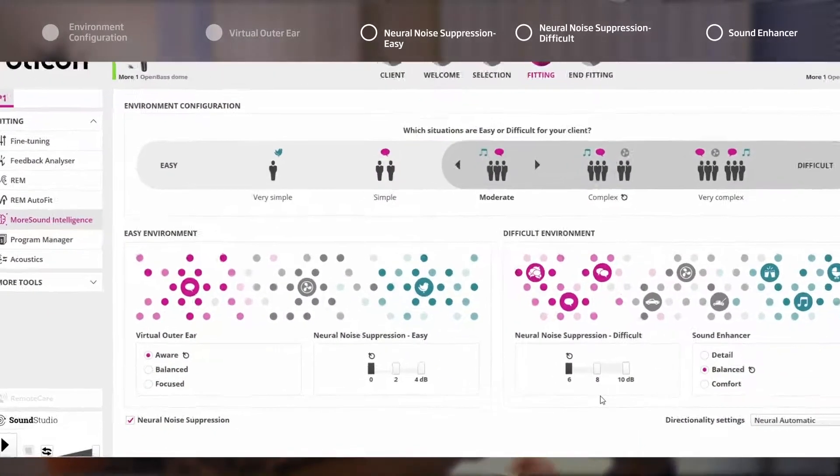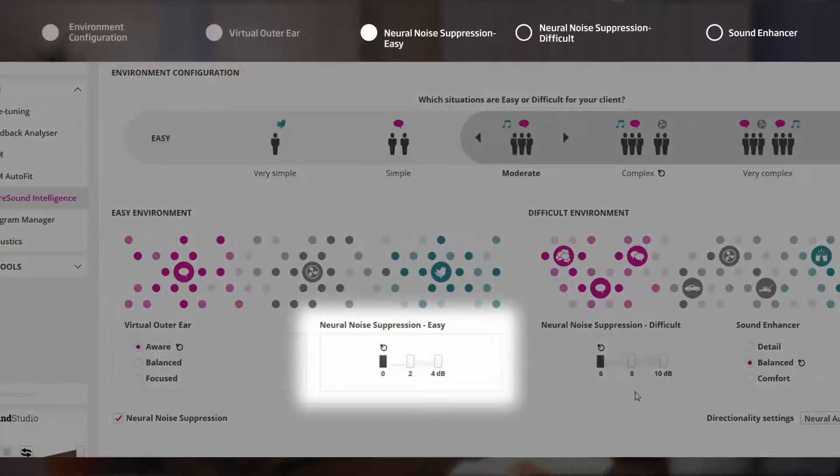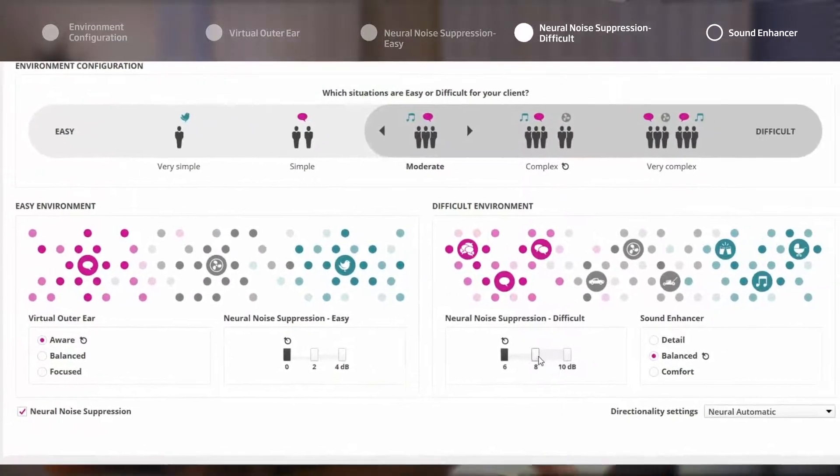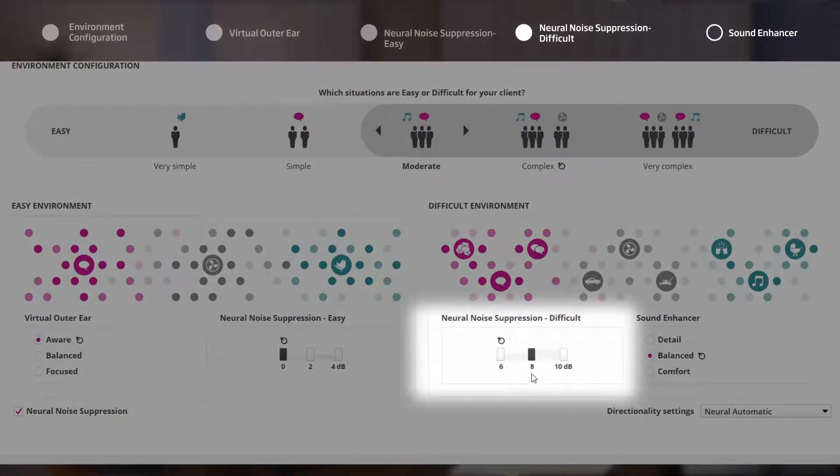No alteration has been made for Neural Noise Suppression in easy settings. Neural Noise Suppression for difficult has now been set at eight decibels. Now the noise suppression will activate at an earlier stage due to the change in Environment Configuration, meaning that it will take less noise for the system to start helping the user. In difficult environments, the user will now have eight instead of six decibels of noise suppression.